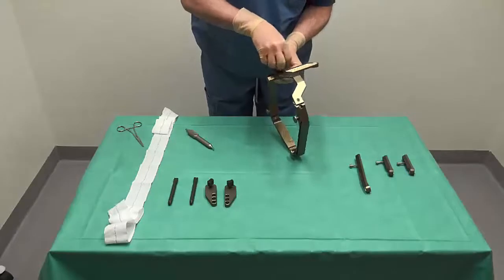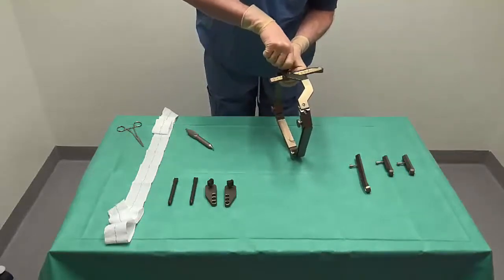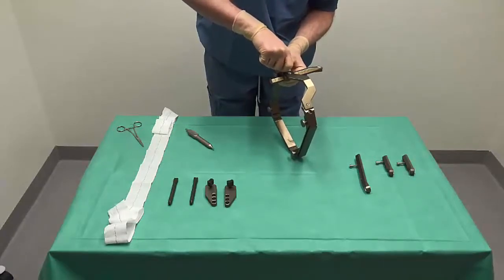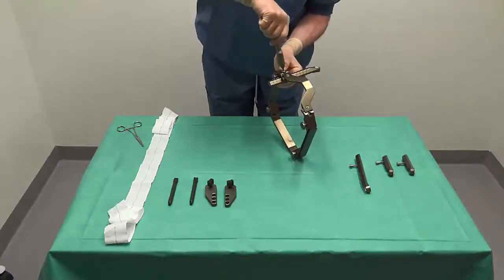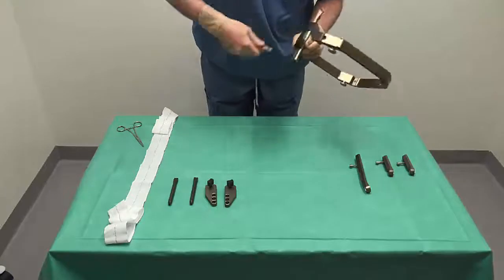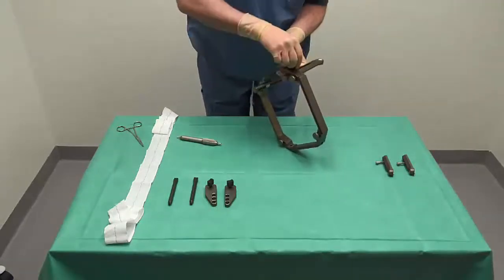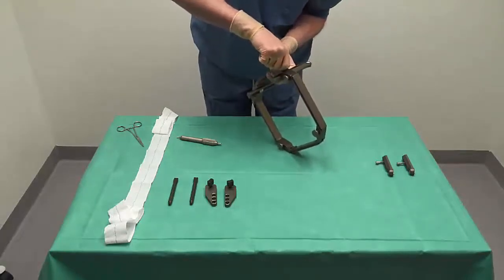In the next step, we apply the frontal fixation posts. These are placed such that the inferior end of the post protrudes 3.5 cm below the lower edge of the frame, and the sixth line from the top should then be at the upper edge of the frame. Remember to make sure that the locking piece is perfectly fitted in the fixation post and that the screw is centered in the hole.